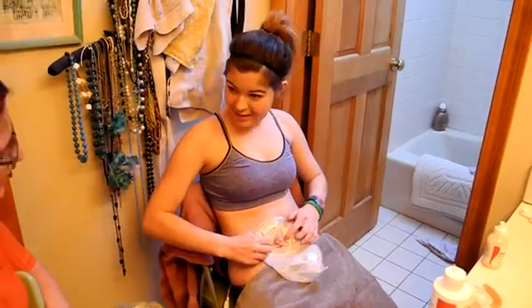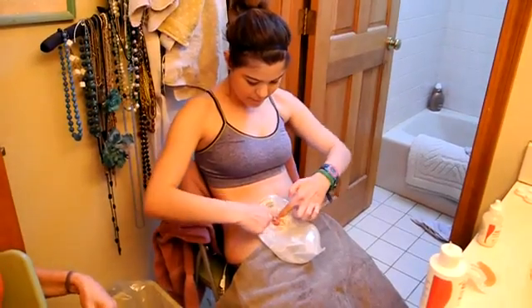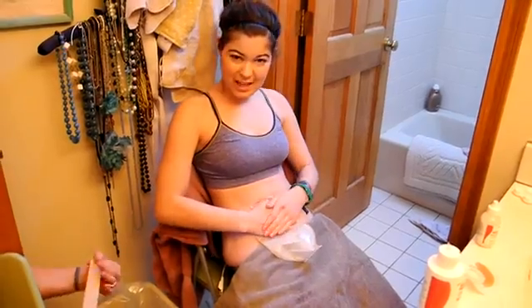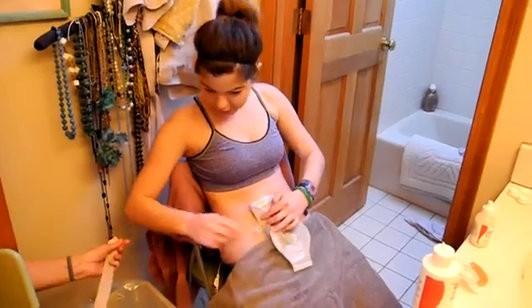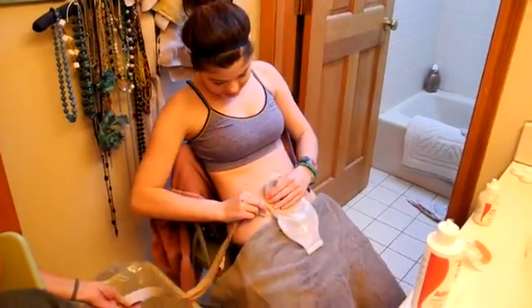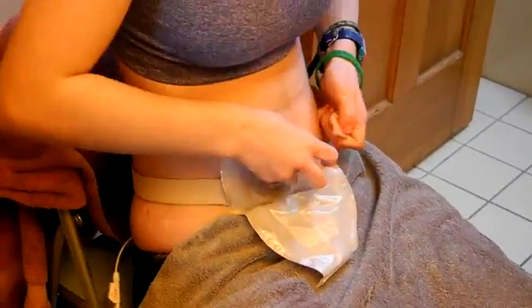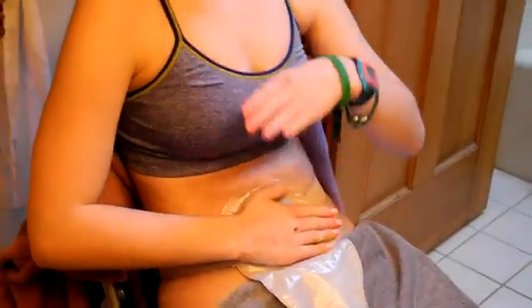Also, oh, well, I don't need to with this, but when I had the flat bag, I used to take it and really press it underneath my stoma. With this, you don't really need that as much. And also with the convex, you have little hooks to hook a belt just to kind of make it a little bit more secure. So you just wrap it around you, and I love the belt. It makes me feel really great. I feel more confident going out in public. It just gives you a little bit more of a hold.